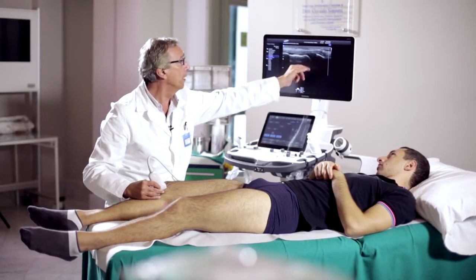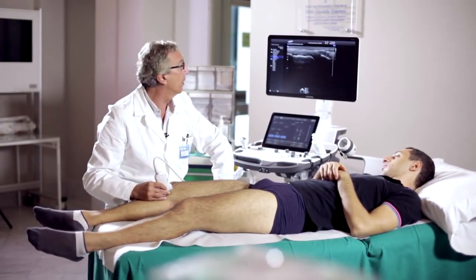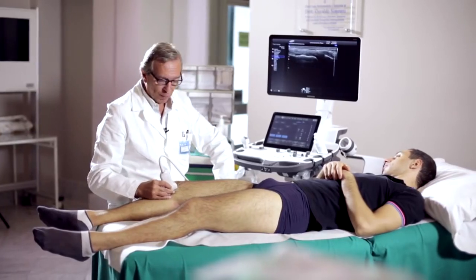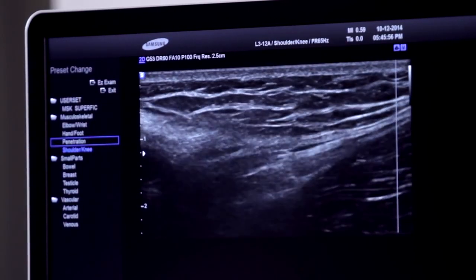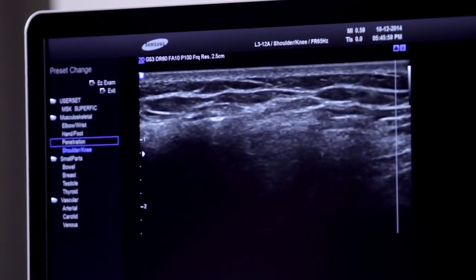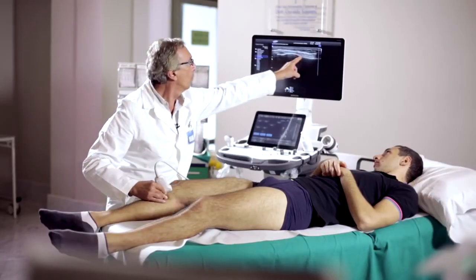This V that we see is the joint line in which, in this case, we can see the medial meniscus. Moving further distally and posteriorly, we can also analyze the so-called goose foot, which is a very important tendinous complex structure inserted at the medial tibial component level. Here we see its laminar hyperechoic appearance.